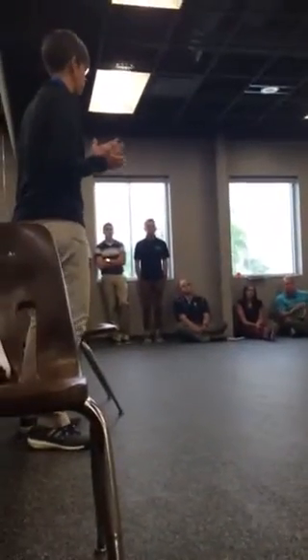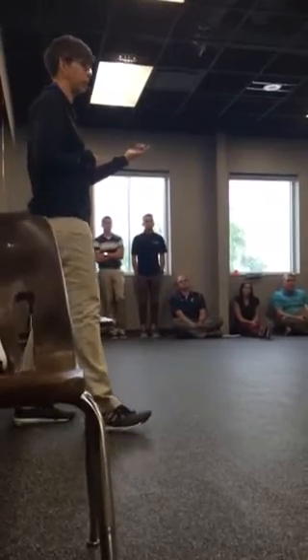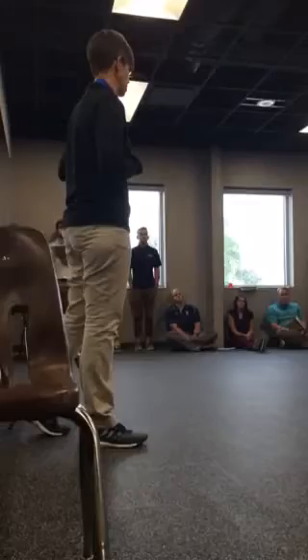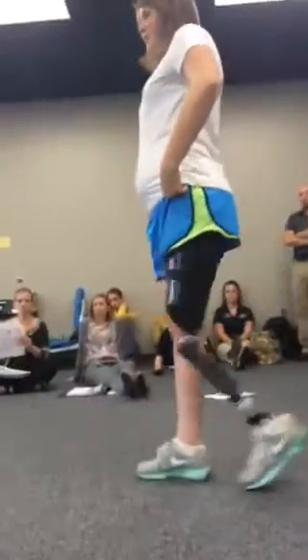But these are Bob Daly's determinants for gait with limb loss: step width, step length, and then the closed chain, the toe load, knee flexion, pelvic rotation, and then trunk rotation. So we're just going to have Kristen walk back and forth a couple times, a couple thousand times, and see.